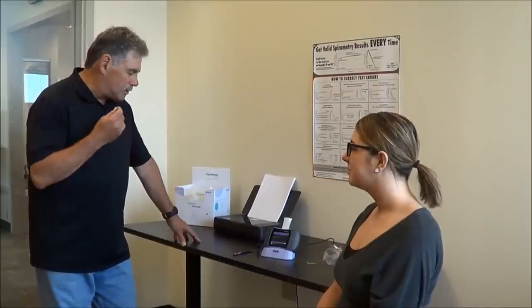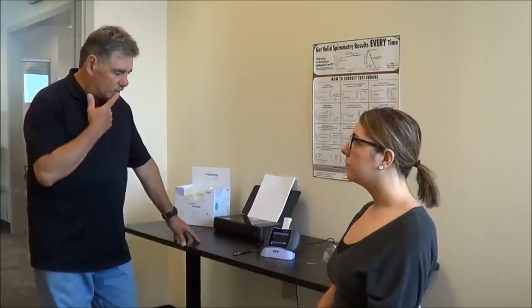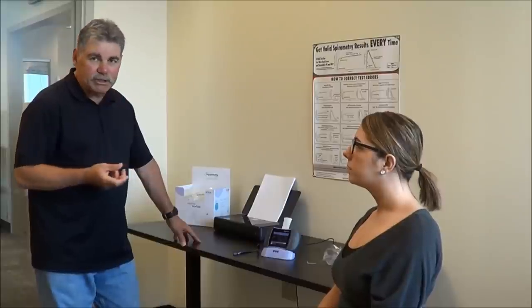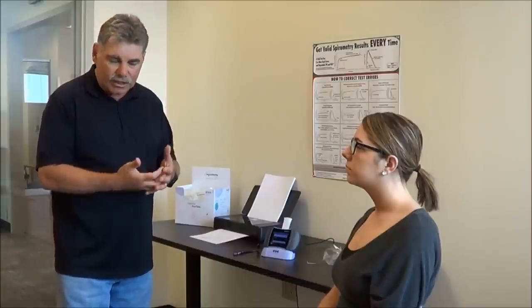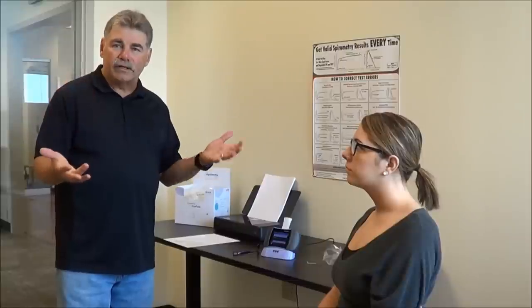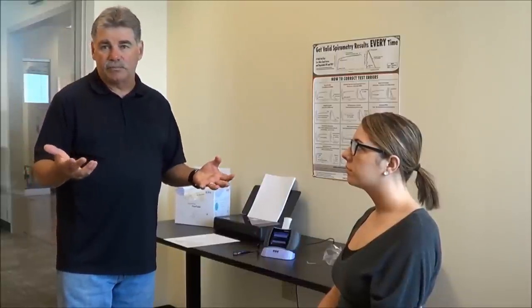Now, also in spirometry, what's common is to do a post-med test, meaning that if I suspect an obstruction, I could administer a bronchodilator to the patient, have them wait 10 or 15 minutes, depending on the drug, and have them repeat the test on a post-trial basis, and then I would be able to compare how well the drug affected her measurements and therefore be able to diagnose possible asthma.